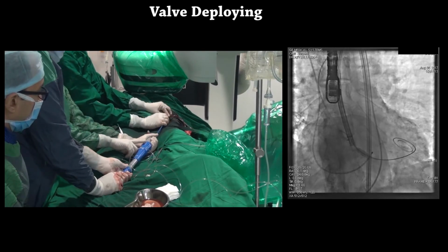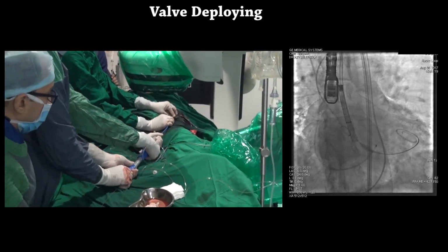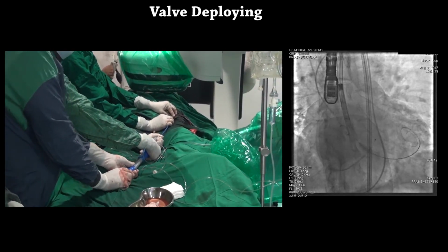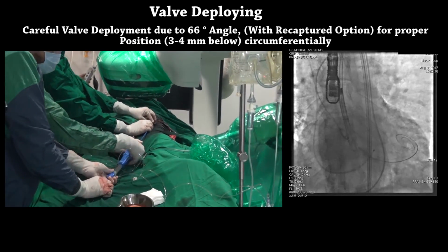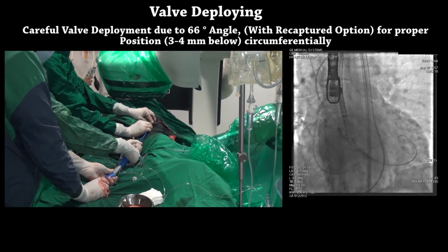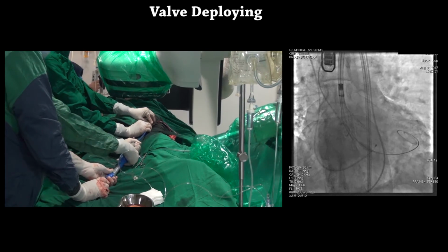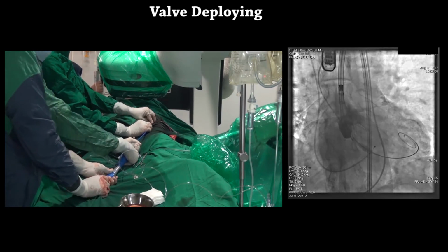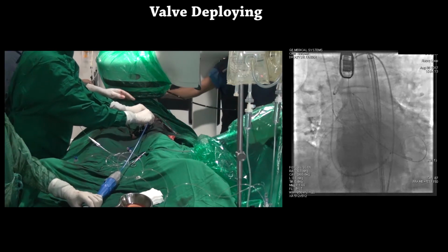The Evolut R easily crossed the valve, and valve deployment was done by the secondary operator in the traditional way. Since Evolut R does have a recapture option, we used that and we kept the position 3 to 4 mm below the aortic annulus. You can see the valve being deployed slowly. Once the valve was deployed, the system was pulled back.